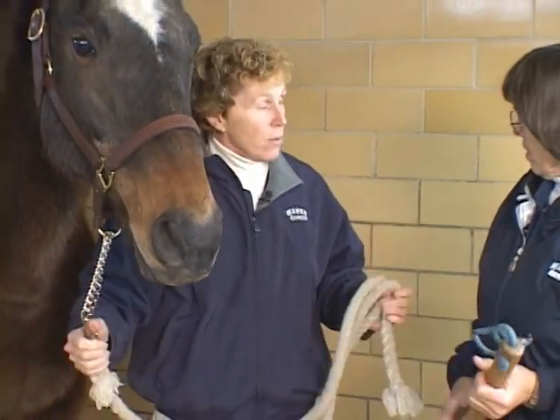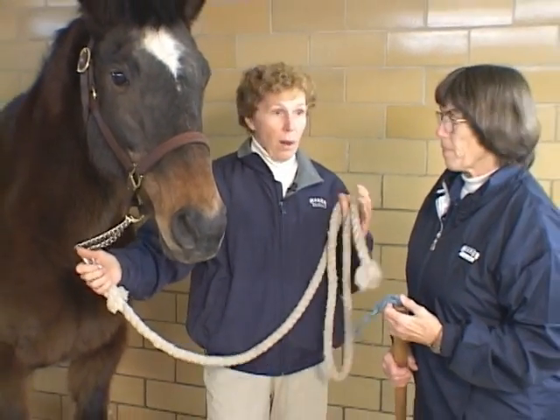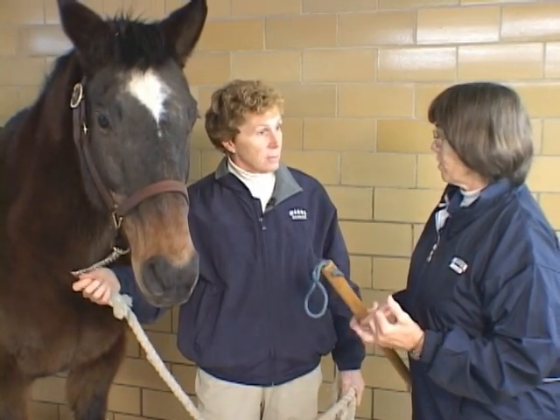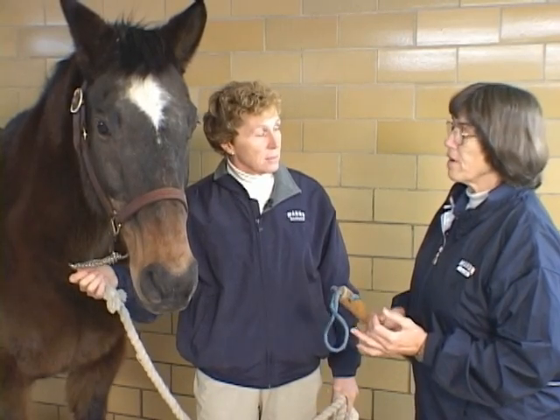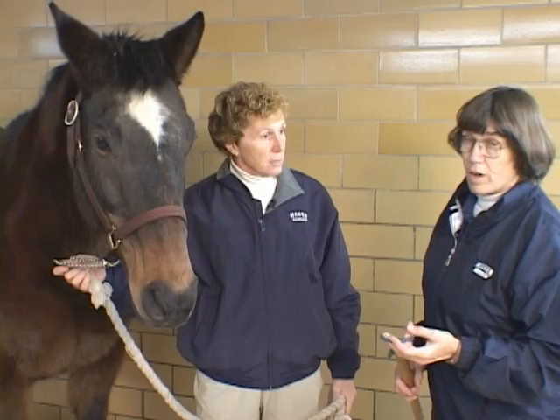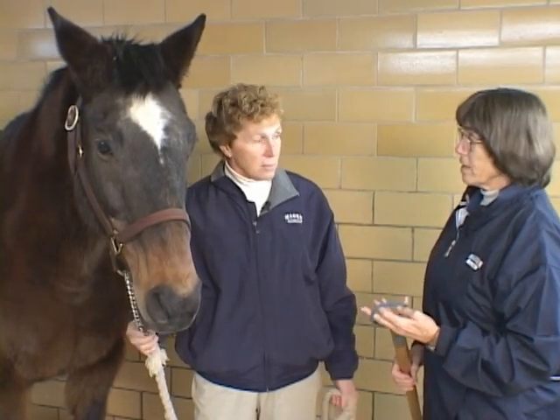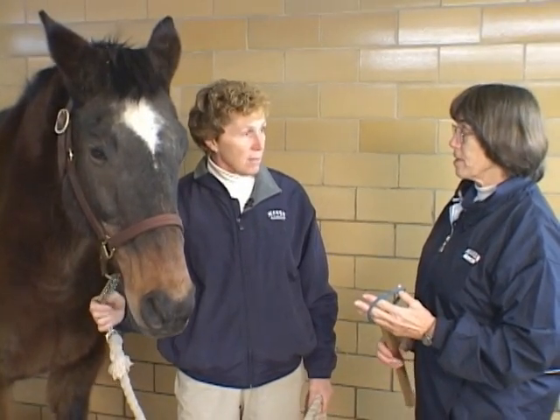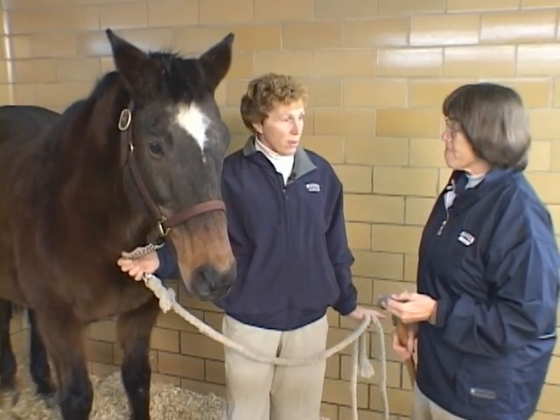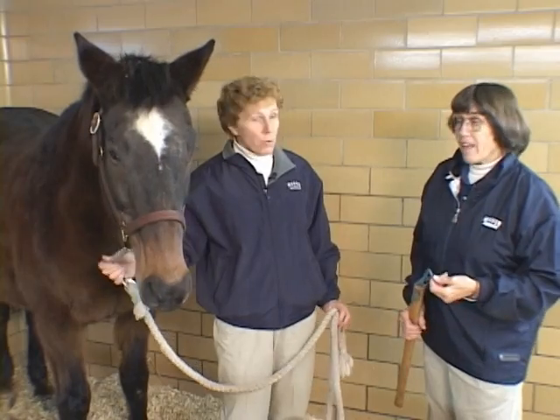If you have a really fractious horse, lots of practitioners will routinely sedate them — it can be a lot safer for both the handlers, the practitioner, and the horse itself. Our sedations are so good nowadays that a lot of clients actually prefer that. And there's no sin in sedating them; there's no point in anybody getting hurt.